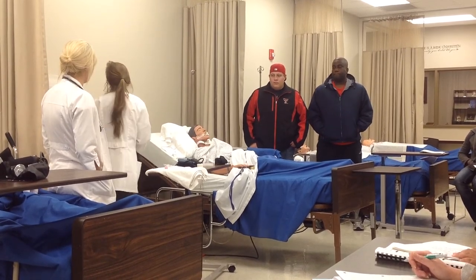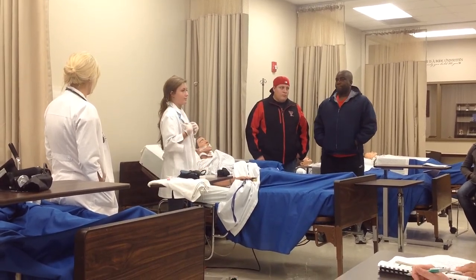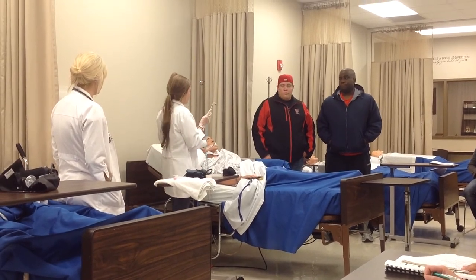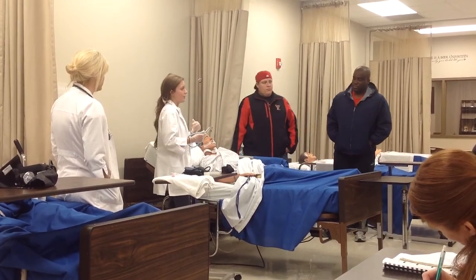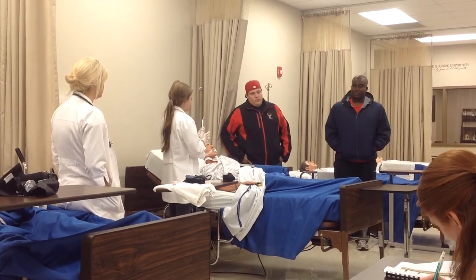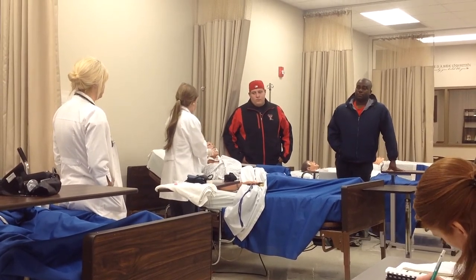So you can put it under the pillow, you can put it in the top drawer, whatever you want to do. And then right after you suction, you need to do another full respiratory assessment. So you do all the lung sounds. When you do that assessment right after you put this in, you're going to hear gurgling and crackling. That's how you know there's stuff in there that you need to suction out. After you suction, you want to do another one so you can listen to the lungs and see if you need to do more suctioning. So, we'll listen to him.